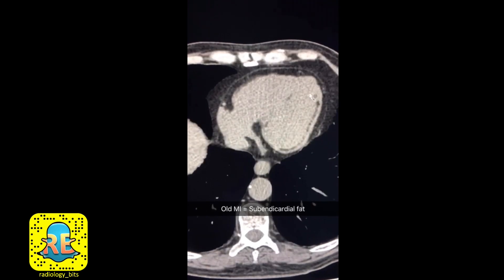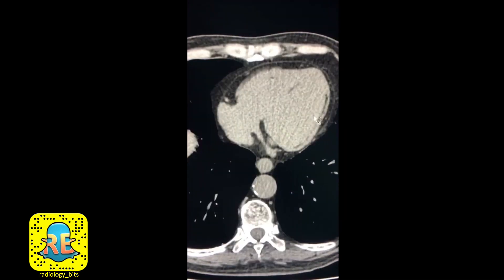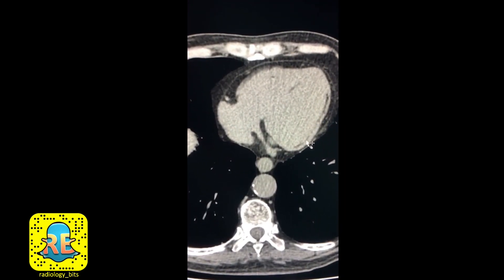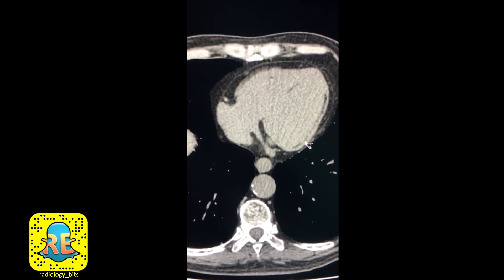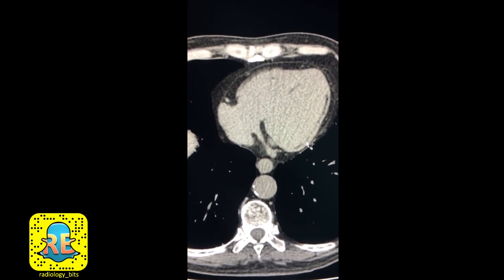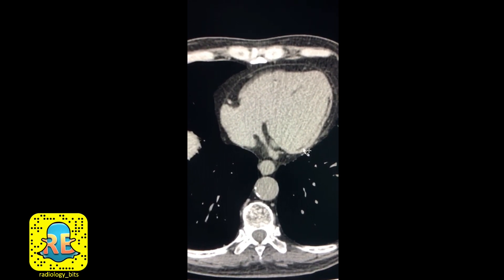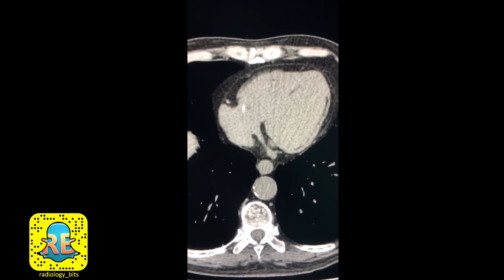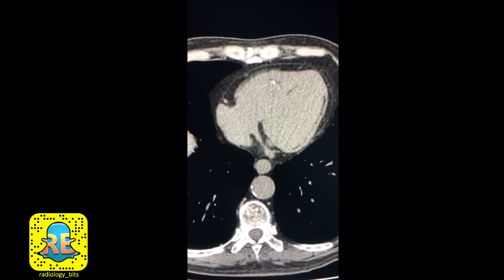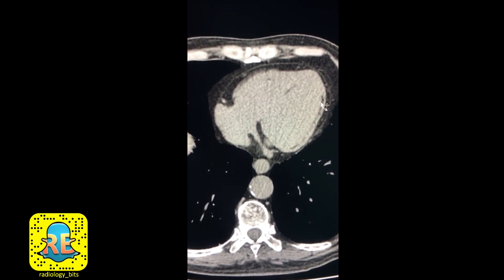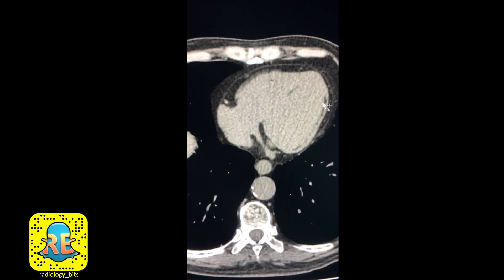Although this is a large area that is difficult to miss, some trainees might miss this. The reason is that if you're practicing radiology, you'll notice many radiologists going quickly over the cardiac structures, especially if the case is done without contrast. That's something to keep in mind — remember that this could be even more difficult if the area of involvement was small.